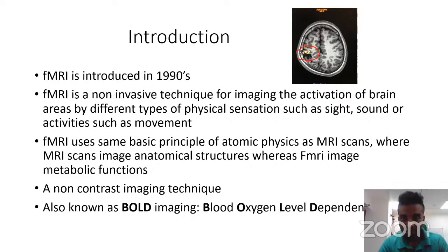See, you could see here, this is basically the precentral gyrus region. This is the region in your brain which controls the movement or tapping of your finger. So when you tap your finger, this region called the precentral gyrus is getting more quantity, or more volume, of blood compared to the other parts of the brain.